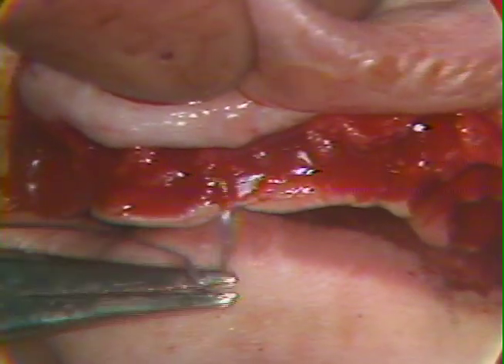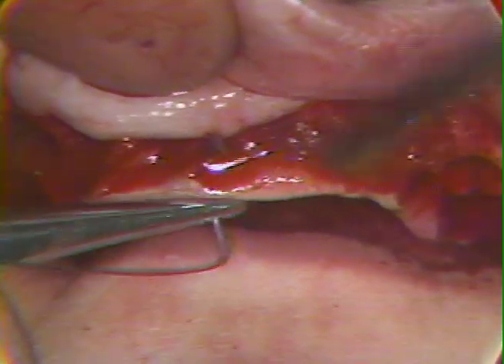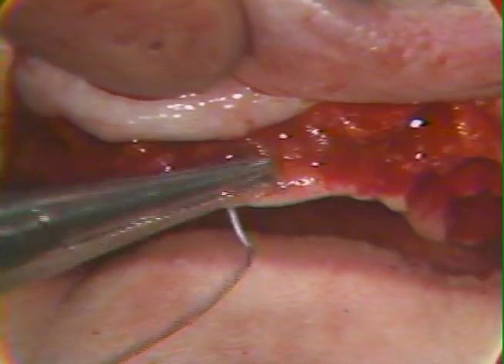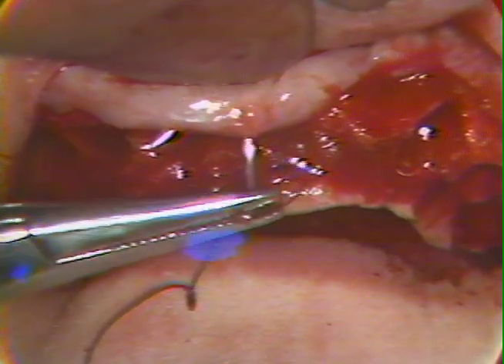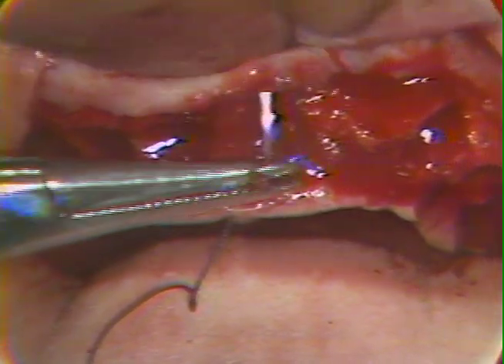And so here is the interradicular bone crest, and we have that soft tissue trimmed. We also will now proceed through the labial. In general, as we'll try to demonstrate in a moment, it's better to insert sutures through the more widely reflected flap and into the more stabilized one.